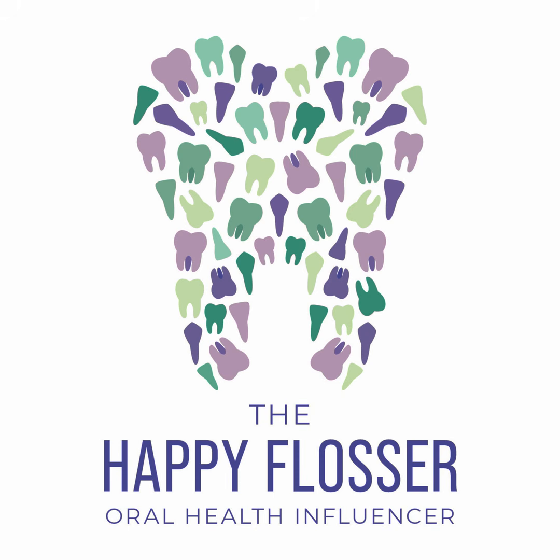We would take updated bite wing x-rays because the patient is due for their routine updated bite wing x-rays. And then we would take a periapical film of tooth number 8 because that patient fractured that tooth and we want to get a look at the apex of that tooth as well.